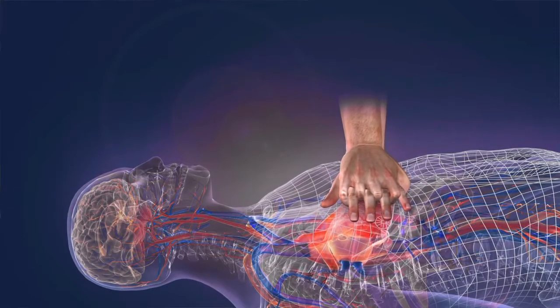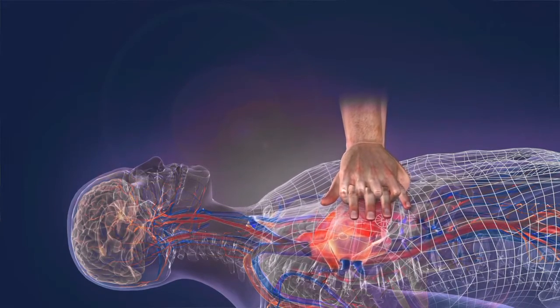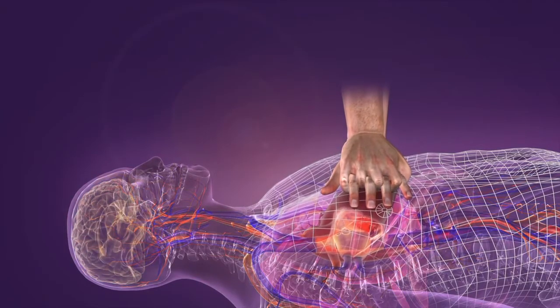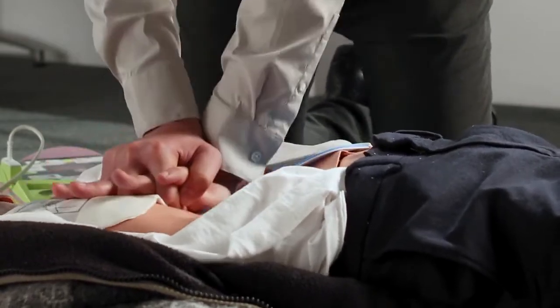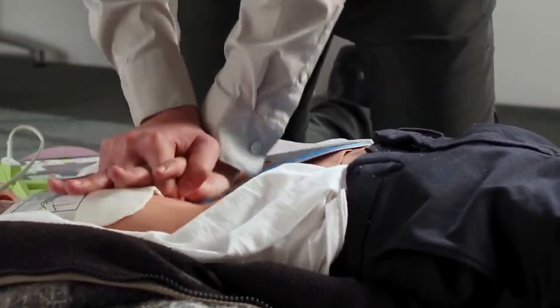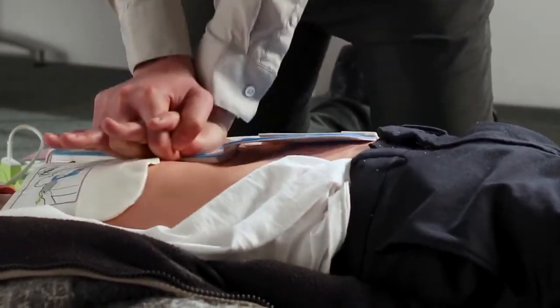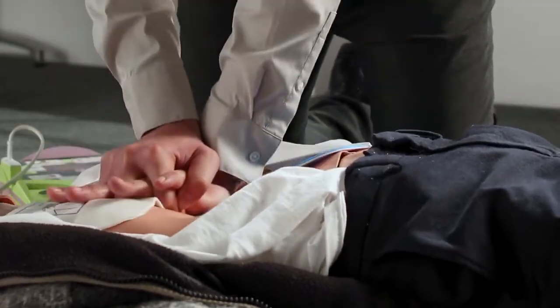High-quality CPR helps maintain the flow of oxygenated blood to the heart and brain. Maintaining the flow of oxygenated blood can improve shock success and minimize long-term damage to the heart and brain. The CPR sensor built into the CPR-D pads allows the AED Plus to see when you are doing CPR, as well as measure the quality of the compressions being performed in accordance with the most current guidelines.